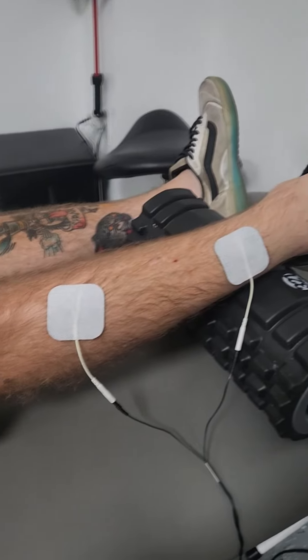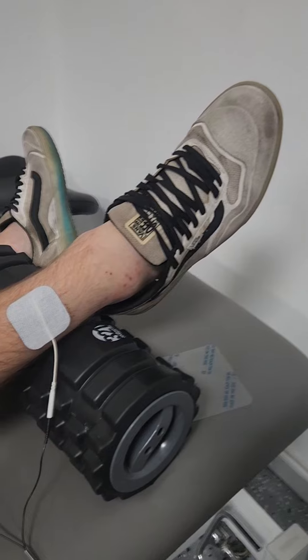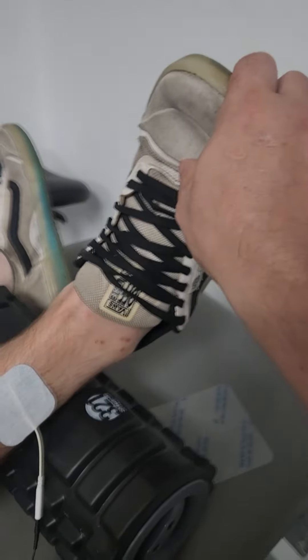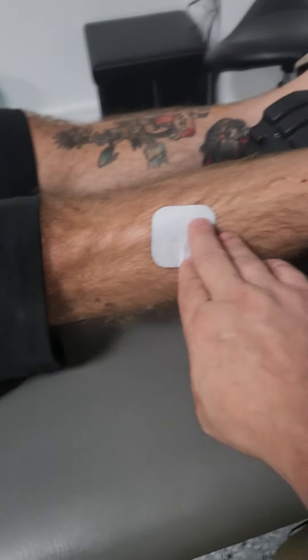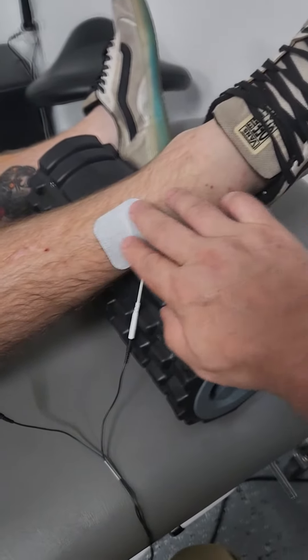This is how I want you to set up your stimulation for dorsiflexion, which is the ankle movement — that's dorsiflexion. You're getting a little bit of inversion, try to come up a little straighter here. So when you set them up, put an electrode right towards the tendon, one on the muscle belly. The whole muscle runs this course right through here, so it's supposed to become tendon right there.